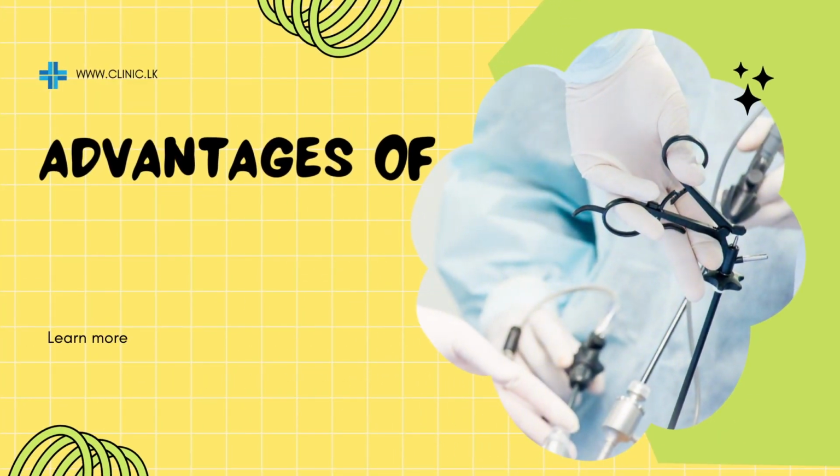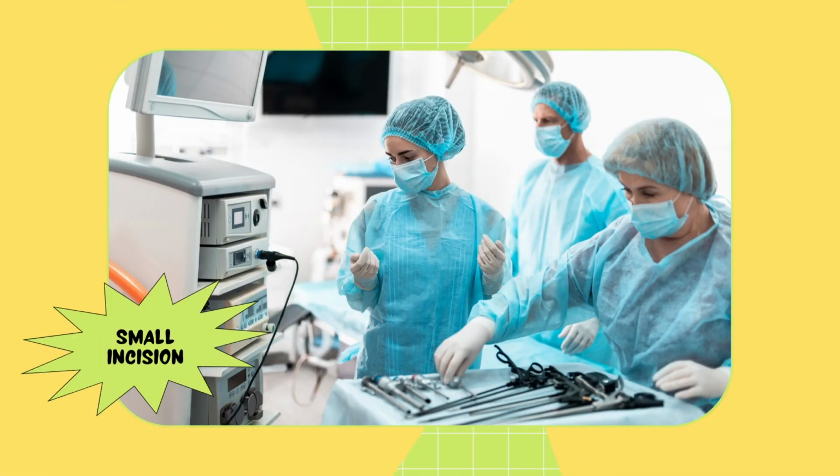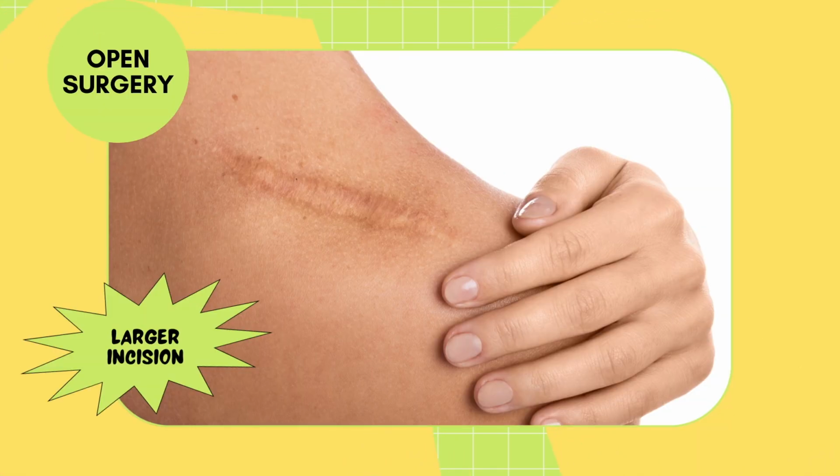Laparoscopic surgery, also known as minimally invasive surgery, is a modern surgical technique that uses small incisions and specialized instruments to perform procedures inside the body. It offers several advantages over traditional open surgery, which involves larger incisions and direct visualization of the surgical site. Here are the basics of laparoscopic surgery and its advantages.